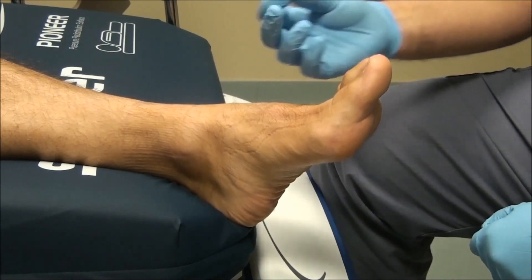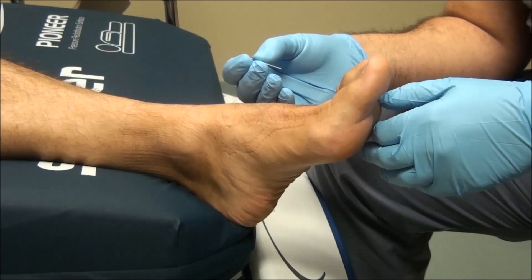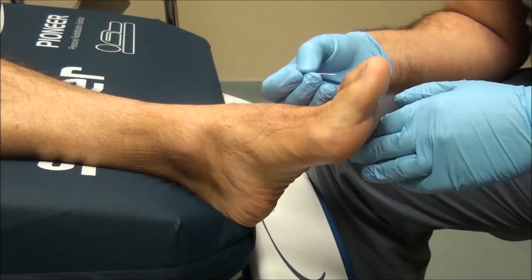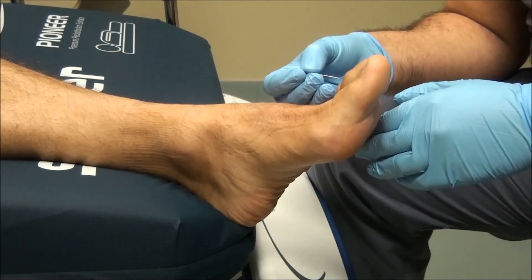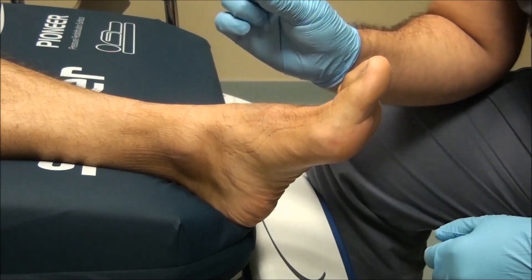This is for sensation of pinprick. On the diabetic foot we have three dermatomes that we can test: the L4, L5, and S1 on the lateral side of the foot over the fifth toe. The test is very simple and easy to perform using a disposable pin.